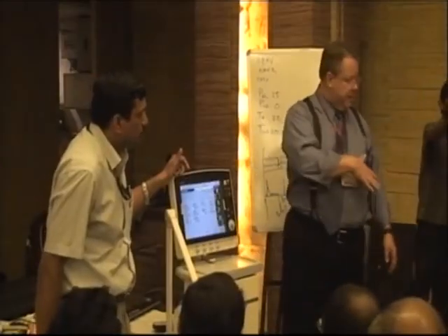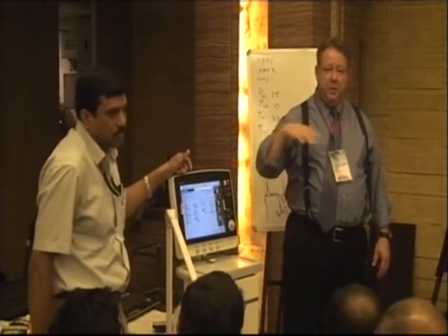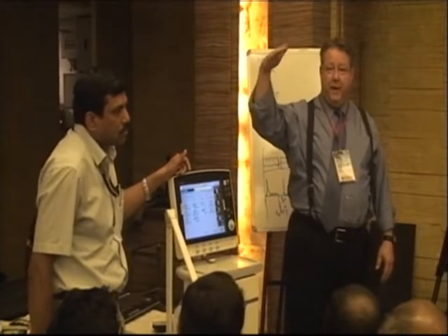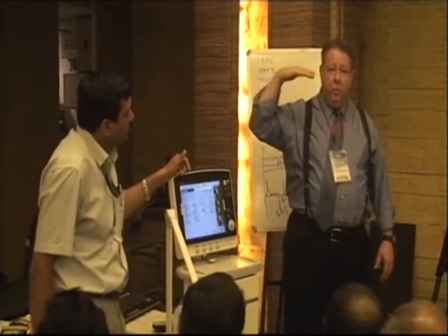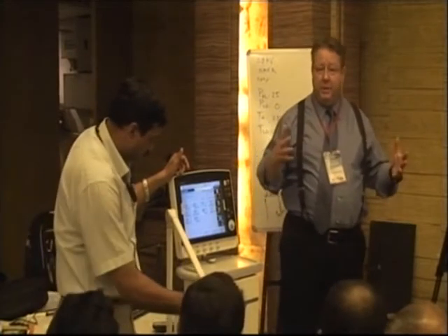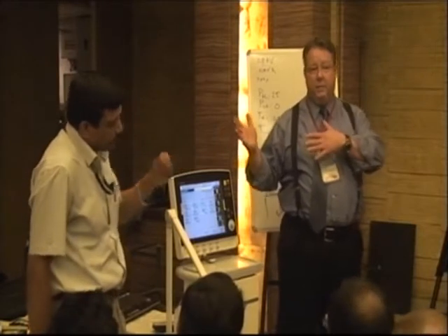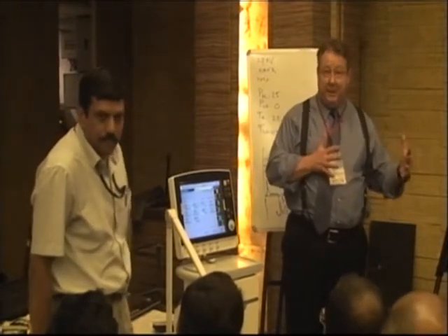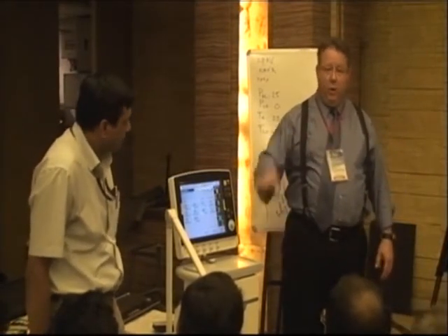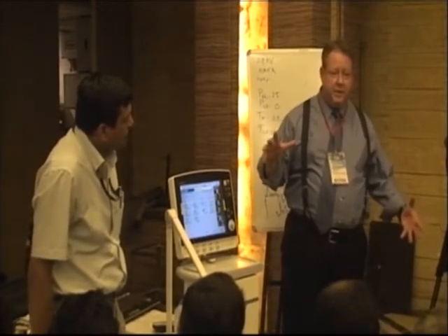Somebody asked here, and I think it's worthwhile for everybody, is there a limit to how high we would set the P high? Most people would say between 30 and 35 would probably be as high as we would go, worrying that our confined lung segments are getting overdistended and that you're probably running the risk of hurting them. Those patients are then either going to be converted to the oscillator, which maintains your mean airway pressure maybe a little bit better than this will, or you're going to have to work with lower pressures and accept that you're not going to have quite that distension that you want.